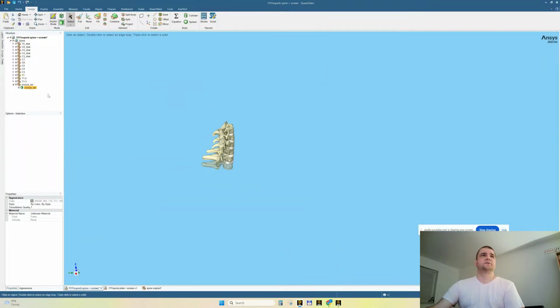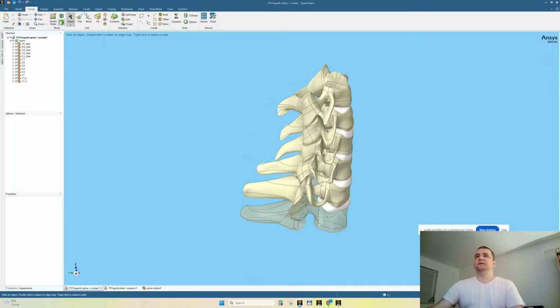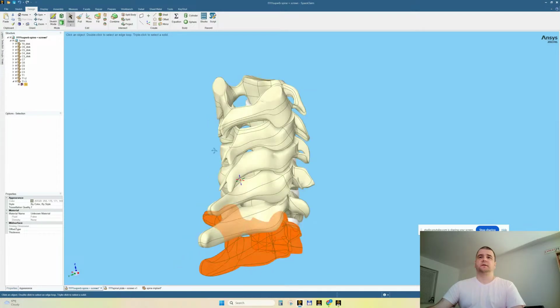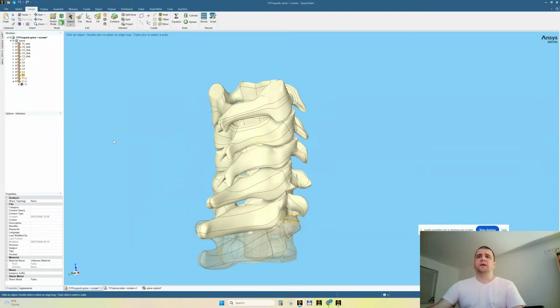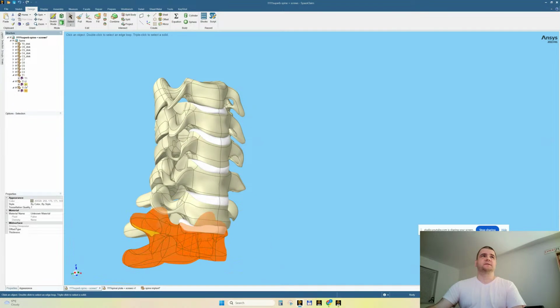Why is this coccyx here? I don't see it. I don't care about it. Let's see if we have only these parts. Yes, I don't want extra parts. Let's heal this because you can see that it is a surface body. What I do not like is, what is this? T12? What? T1. This thoracic vertebrae is kind of split in multiple surfaces.